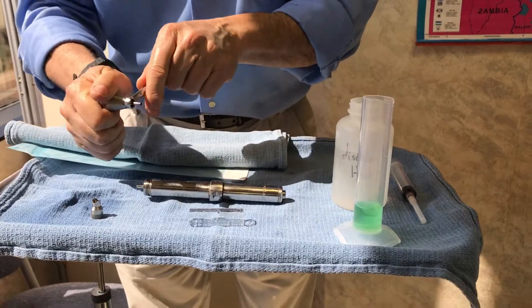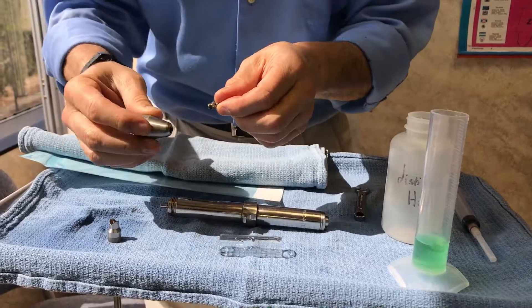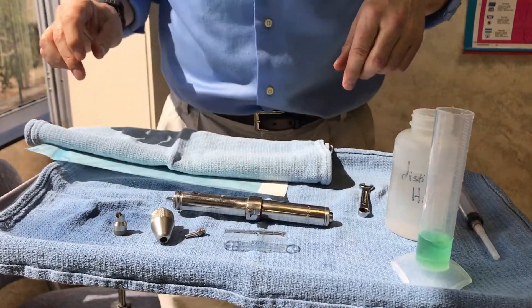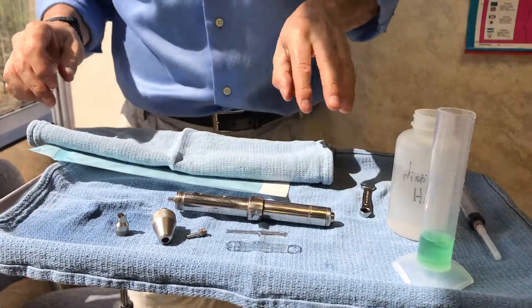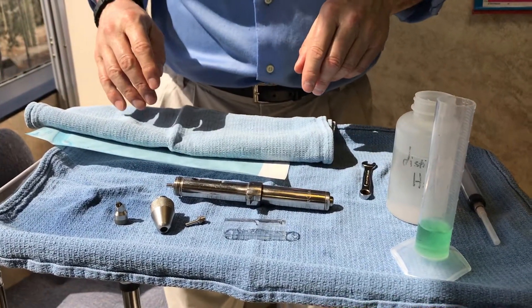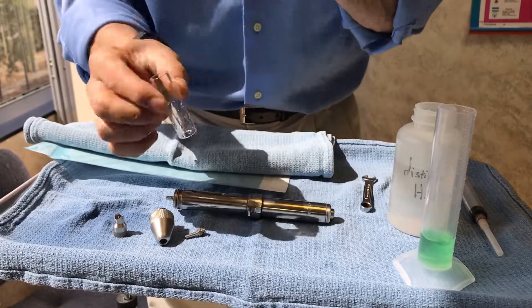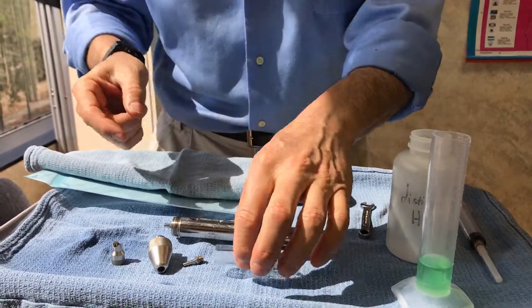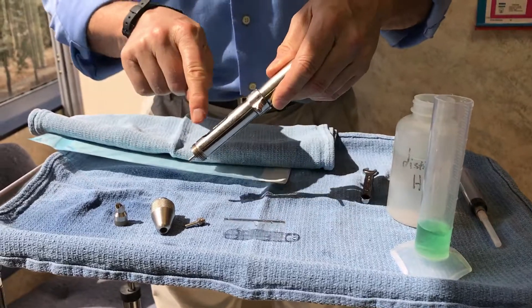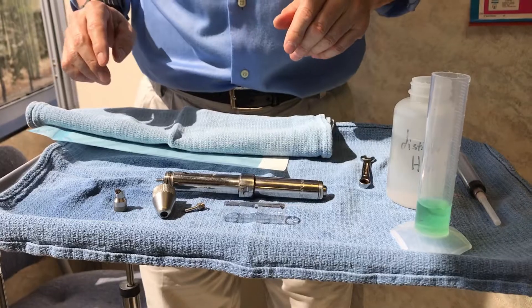I take off the extended tip, because you can see there'll still be a few drops in here. At this point my staff sprays this down with some enzymatic cleaner, rinses it off with tap water. I can wash this out with a little baby bottle brush and sometimes use a toothbrush to get it nice and clean. Then rinse the whole thing with water and let it air dry.